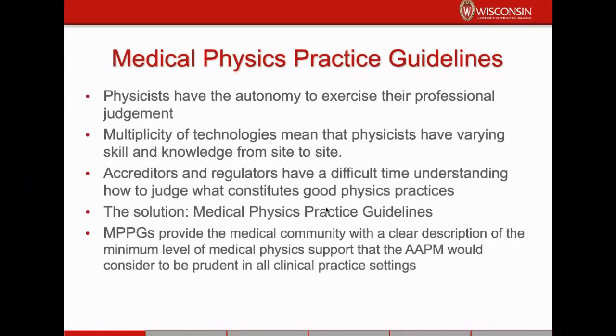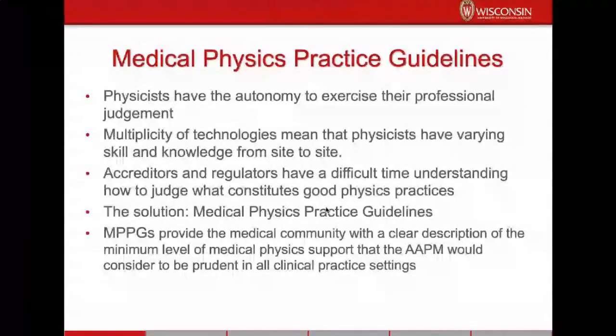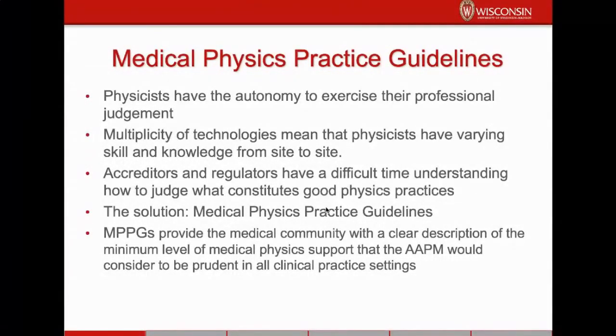They're really an all-encompassing study of a particular topic that is designed to give medical physicists access to all the information that has been studied and acquired on a given topic for all of medical physics. And if you look at an individual task group, a lot of times if you implement every single part of it, it would take you 6 months, and you wouldn't be able to do anything else.